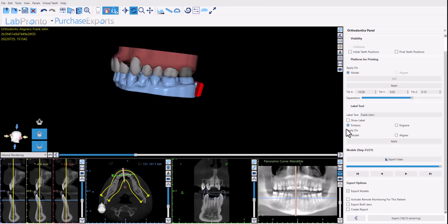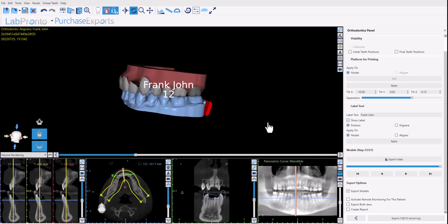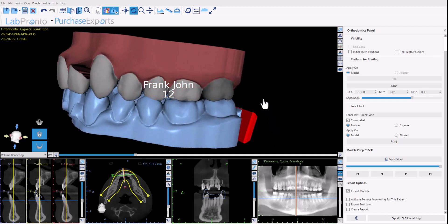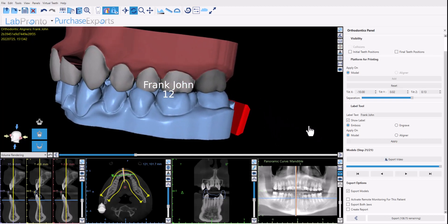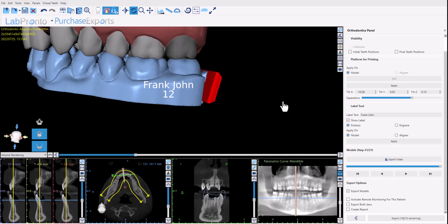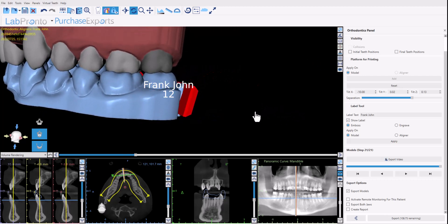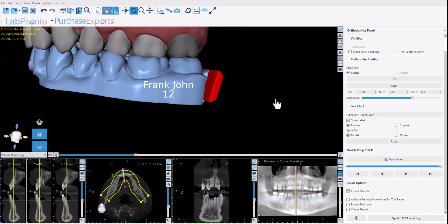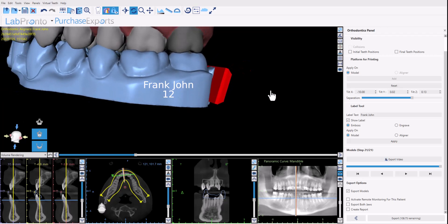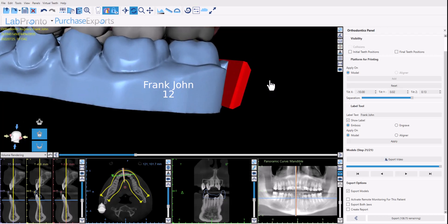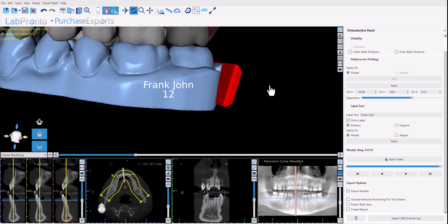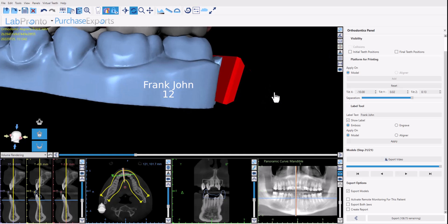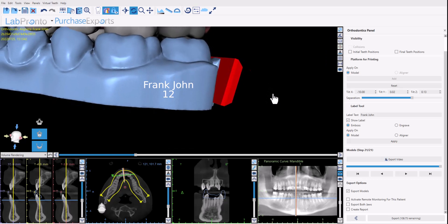The next section that we have here is our labeling tool. So you're able to add a label to the models. Click show label, move the jaws and zoom in and zoom out. I move the jaws by holding down the wheel of my mouse and moving the jaws around, and zoom in and zoom out by sliding the mouse backwards and forwards while holding down the right mouse button in order to position the text accordingly.